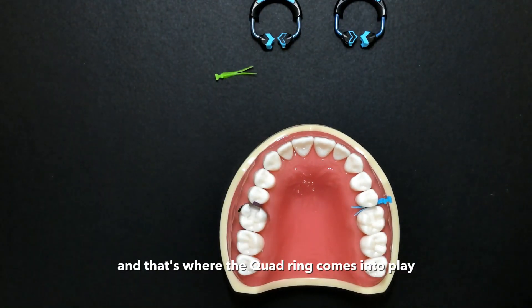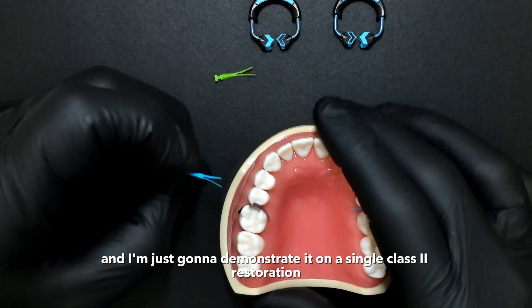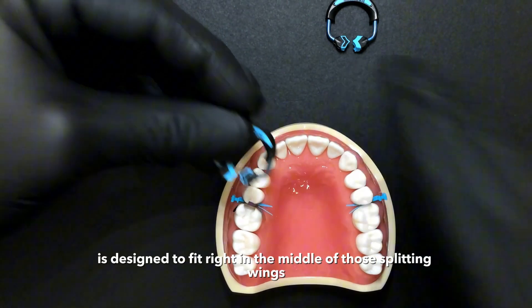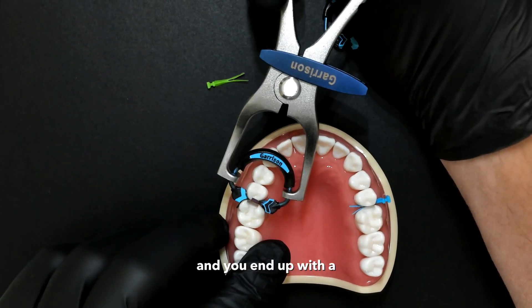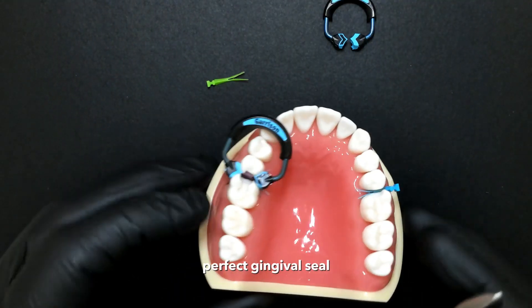And that's where the quad ring comes into play. I'm going to demonstrate it on a single class two restoration on this side. We're just going to place our wedge, and then the driver tip, which is marked in black, is designed to fit right in the middle of those splitting wings. And you end up with a perfect gingival seal.